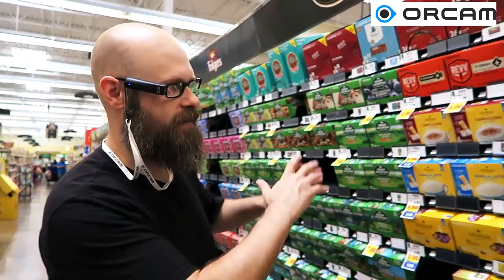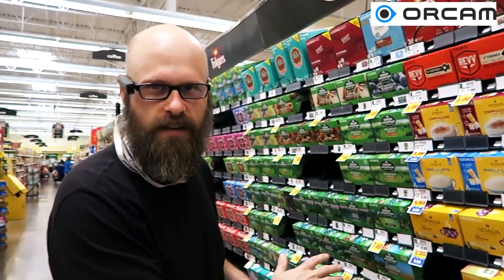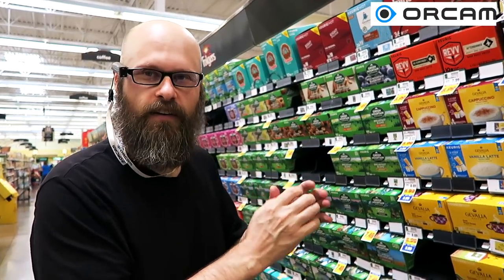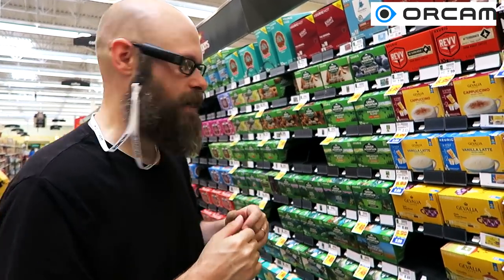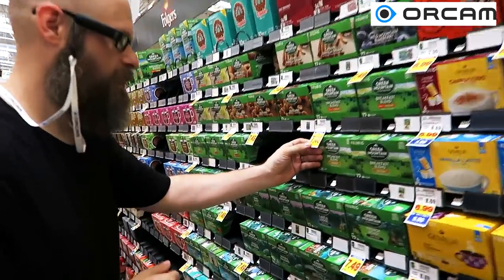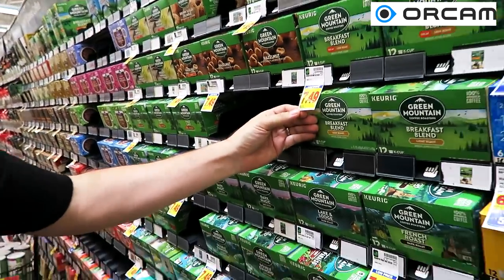Okay, so this would be a good test for the OrCam. We're looking at the coffee section here, the K-cups, and there is a lot of information here. This will be a test of how well it narrows in on a specific thing that I want it to read — like one of these price tags here. I'm going to point at the price tag and see if it reads it.